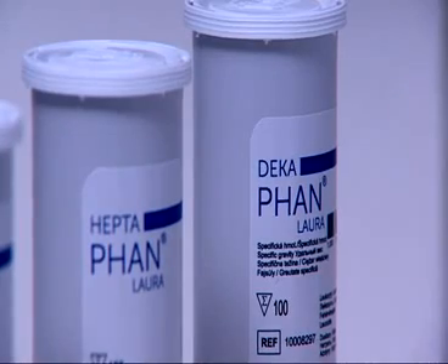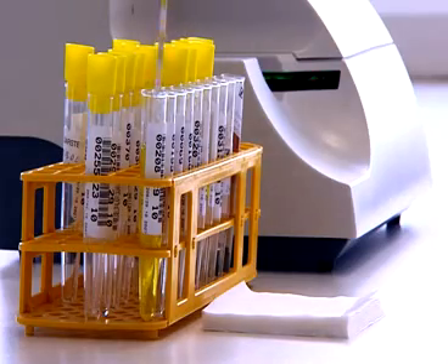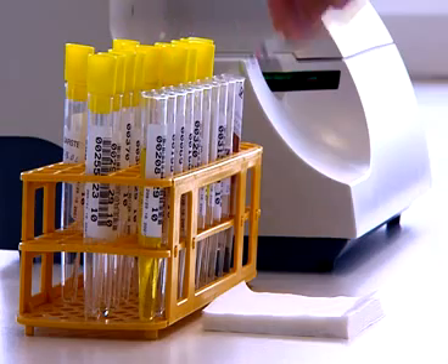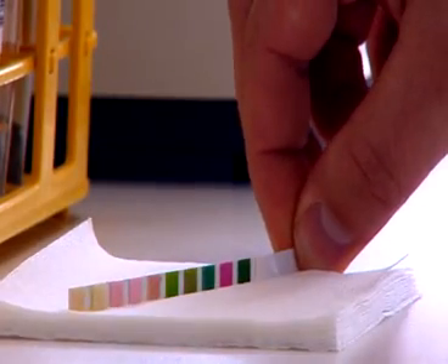This machine can automatically detect the type of diagnostic strip inserted. It measures two types of diagnostic strips for 7 or 10 parameters at a speed of 400 strips per hour.